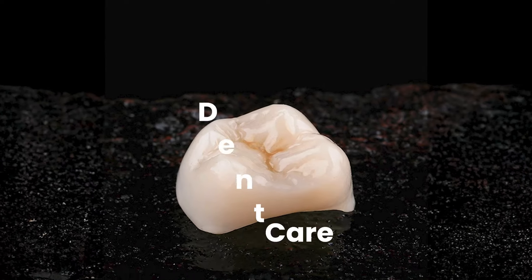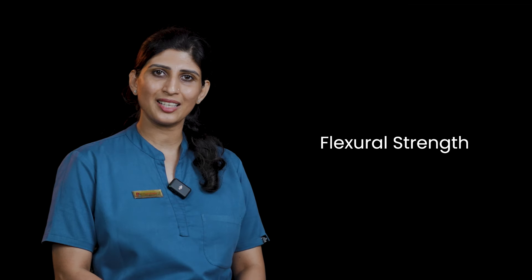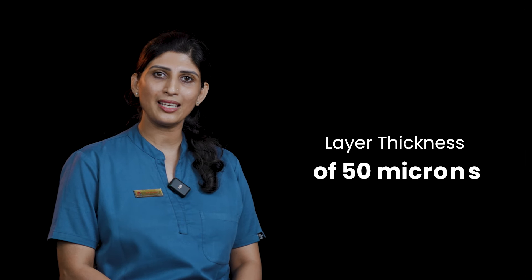Are you ready to revolutionize your dental practice with Dencare Permaprint, the future of dental restoration? With flexural strength of 150 MPa and layer thickness of 50 microns, Dencare Permaprint offers unmatched durability and precision.